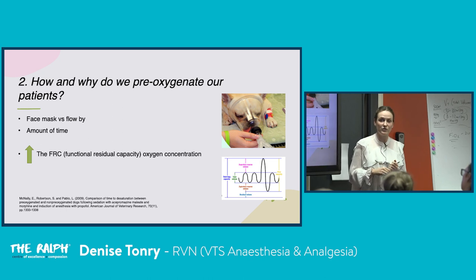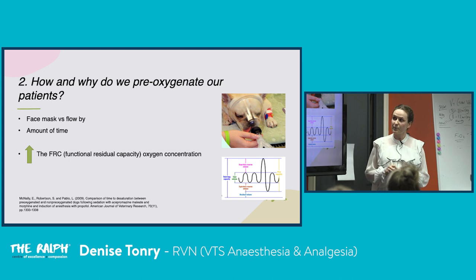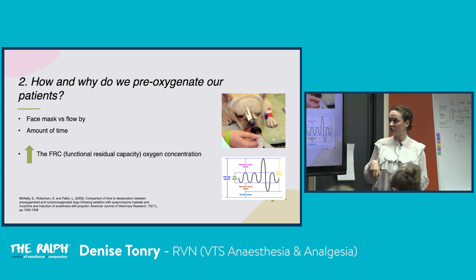And it's very often, even when I'm doing them every day, they're not pre-medded enough yet. They're still moving their face quite a lot. For any patient that you can, the recommended pre-oxygenation is with a tight-fitting face mask for 3 minutes. That will achieve maybe an FiO2, I may forget this number, closer to 60-70%. And as you can see, the classic representation of this is a French bulldog. They really benefit from having this pre-oxygenation, and we'll go through why.